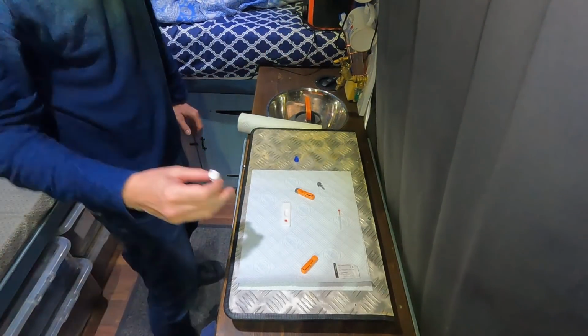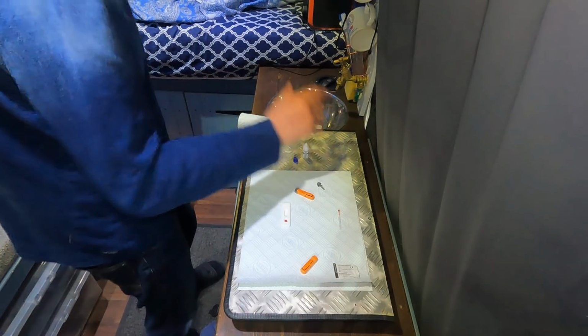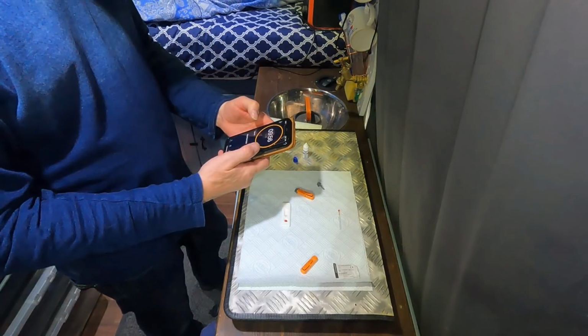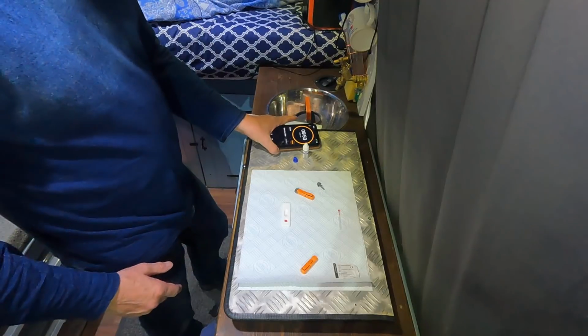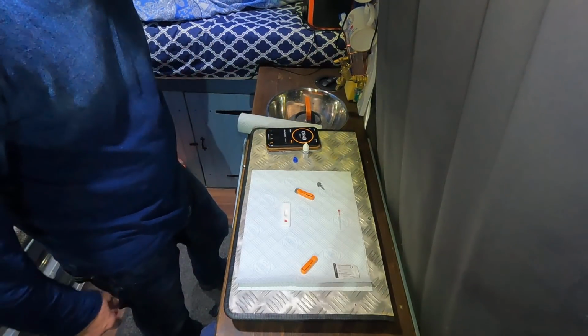4. Right. Now we wait exactly 10 minutes. So I've got my phone. Got it set for 10 minutes. So now I need to leave that for 10 minutes. Oh look, it's going up. There's a line going up inside it. It said that would happen.